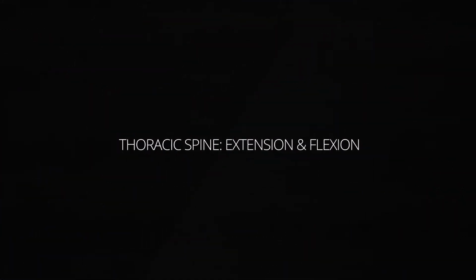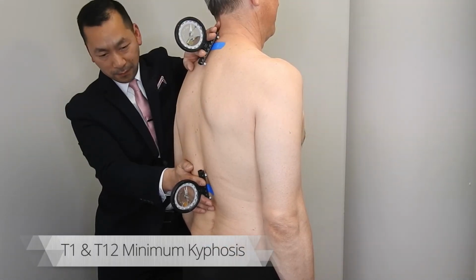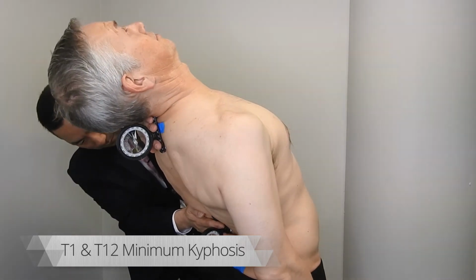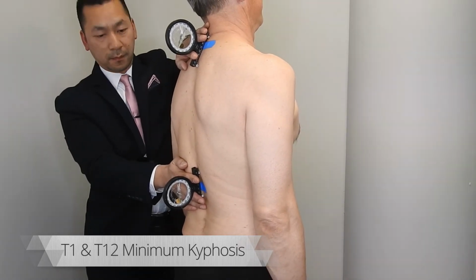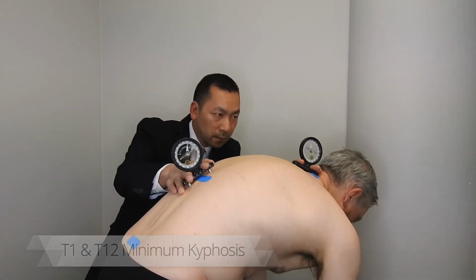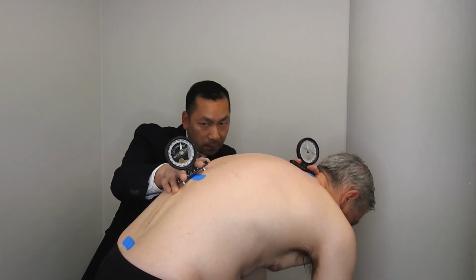Thoracic spine, extension and flexion. Minimum kyphosis is at the maximum military brace position. Extension beyond this, or forward flexion of the thoracic spine, may be measured. Subtract T12 from T1 to obtain the degrees of movement.